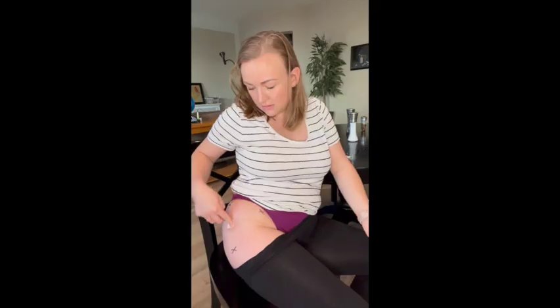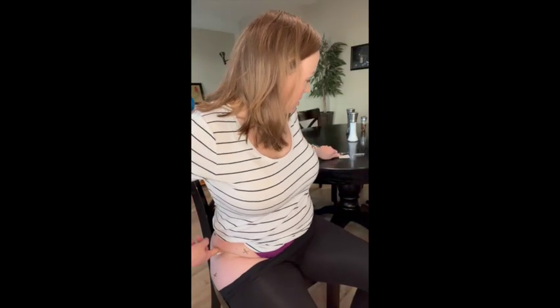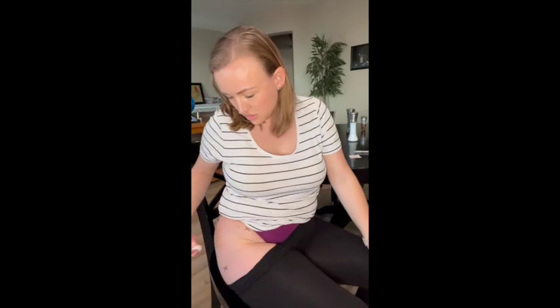Then we're going to remove quickly. I don't have too much bleeding, just a little dot — I'm going to hold some pressure on there. Dispose of your sharp in your sharps container that you hopefully got from your pharmacy; otherwise you'll need to get a sharps container and dispose of it properly. Pain is really not bad at all, especially if you poke quickly, then inject the solution slowly, then remove the needle quickly. Those are the keys to reducing pain. If you're slowly pushing the needle in, it's going to make those nerves hurt more. So: quick in, slow injection, then quick out — then get your gauze or use the alcohol swab to hold pressure, which is usually just fine.